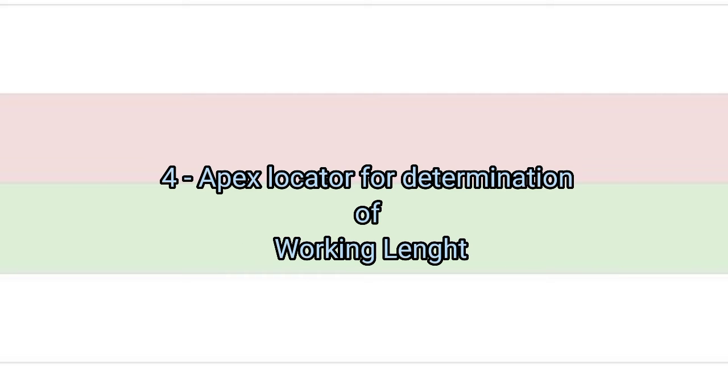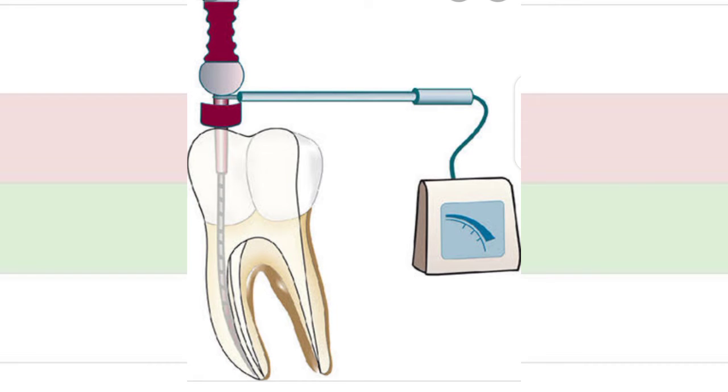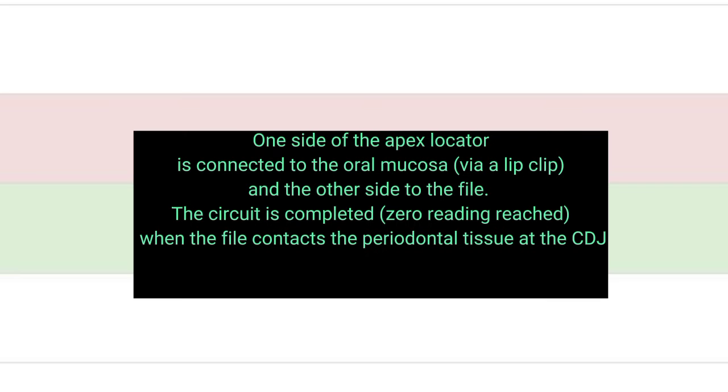The next method of locating working length is by using apex locator. Apex locator works by using the body to complete an electrical circuit. This is the apex locator that is used to locate working length. One side of the apex locator is connected to the oral mucosa through a lip clip and the other side is connected to the file. The circuit is completed when the file contacts the periodontal tissue at the cemento-dentinal junction.